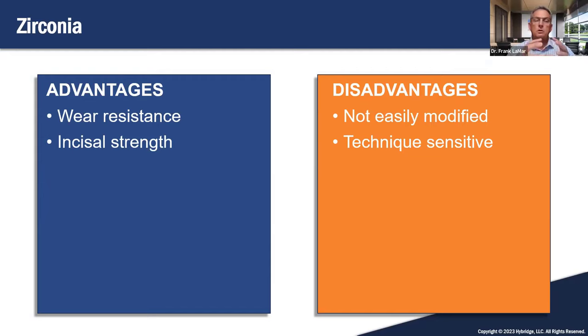But if you've ever had a zirconia restoration that cracked or broke right through a very large area, that was an issue with the technique. It didn't actually sinter. There was a strain in that green state. And that I have found, even in our laboratory, is a really big liability in any laboratory, that issue. Low bond strength.